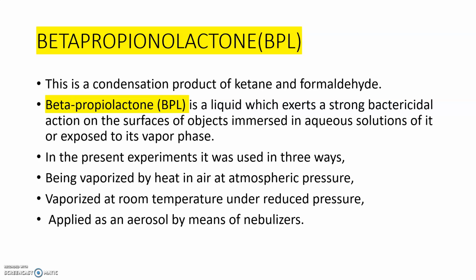In the present experiment, it is used in 3 different ways. How? It is vaporized by heat in air at atmospheric pressure, or vaporized at room temperature under reduced pressure, or it can be applied as an aerosol by means of nebulizers. So these are the 3 methods in which they are applied.